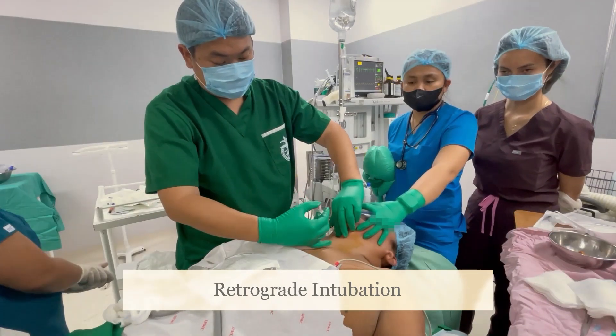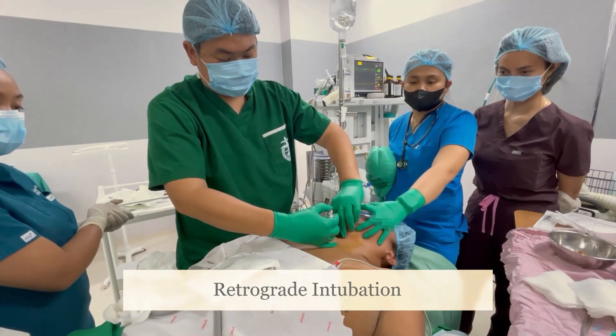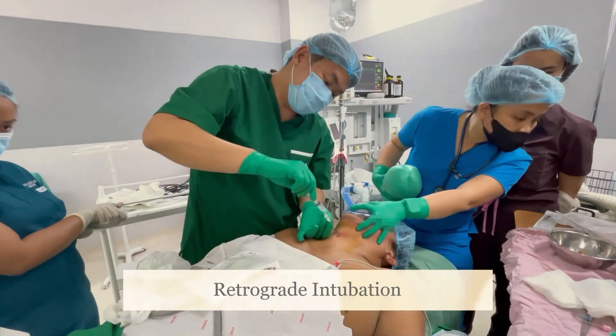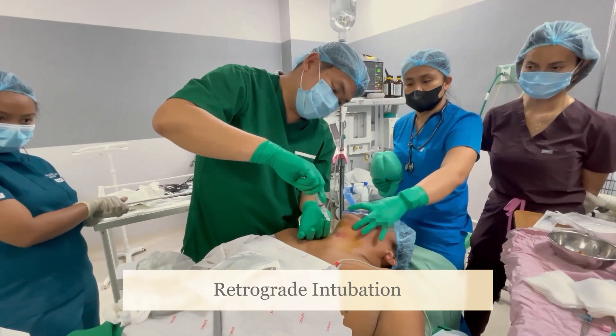Puncture the cricothyroid membrane with a Tuohy needle with the bevel facing lateral. Twist the Tuohy needle to face cephalad. Aspirate with a syringe containing fluids to confirm placement. Insert the epidural catheter.